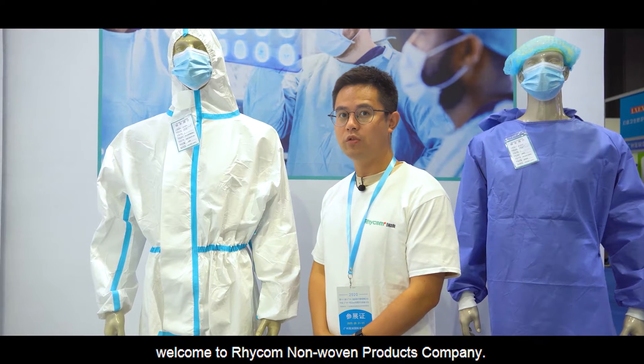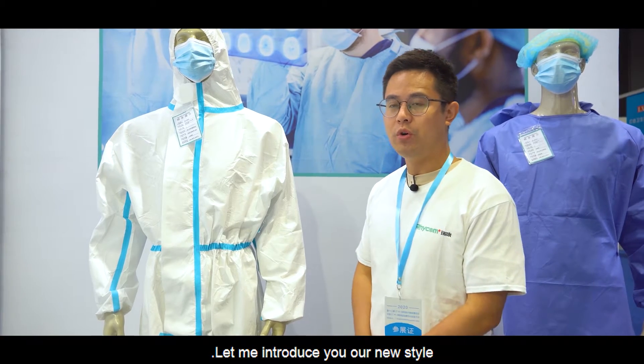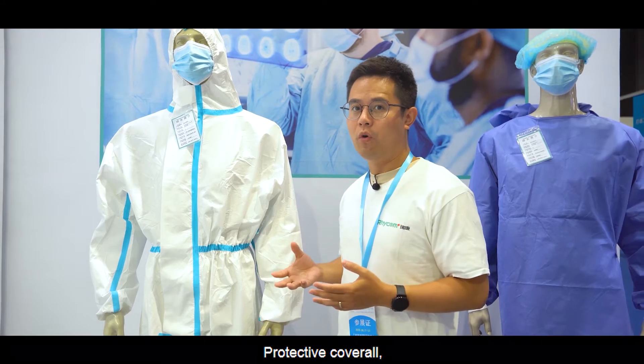Ladies and gentlemen, welcome to Rhycom Non-woven Products Company. Let me introduce you to our new style protective coverall.